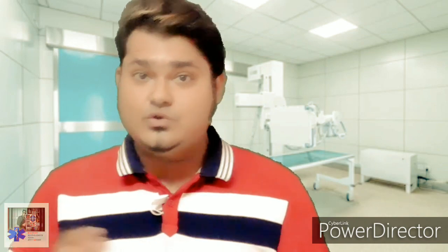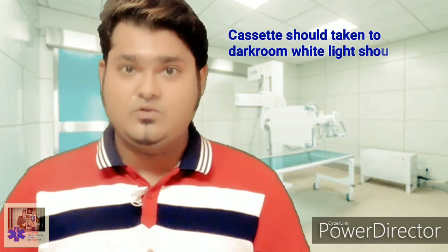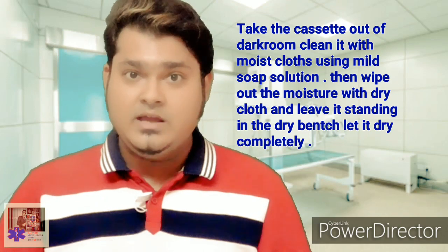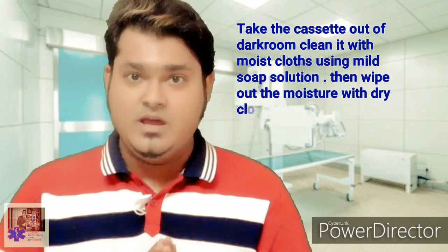To clean the cassette: the cassette contains two white screens which should not be scratched and must be kept away from chemicals, as spots on the screen produce confusing shadows that interfere with diagnostic interpretation. Take the cassette into the dark room, turn off the white light, and turn on the safe light. Open the cassette, remove the film and place it in the film box, then take the cassette out of the dark room. Wipe it with a mild solution, wipe off the extra moisture, and leave the cassette standing upright on a dry bench to dry completely.